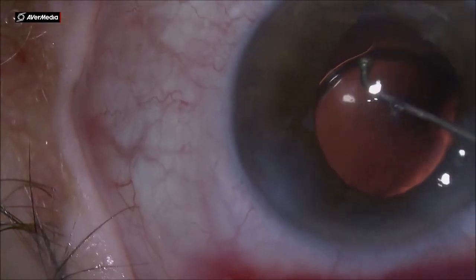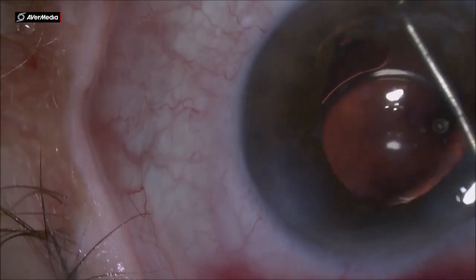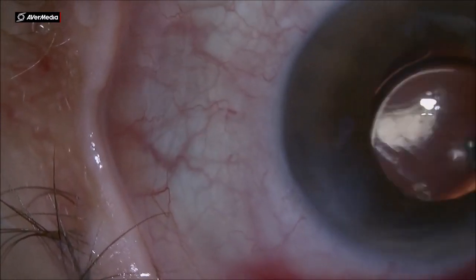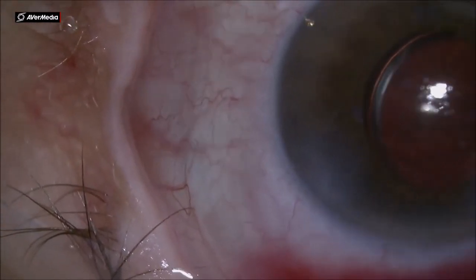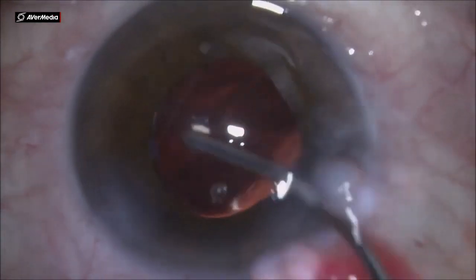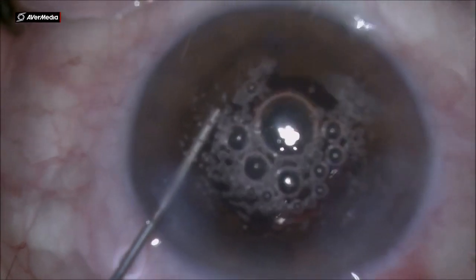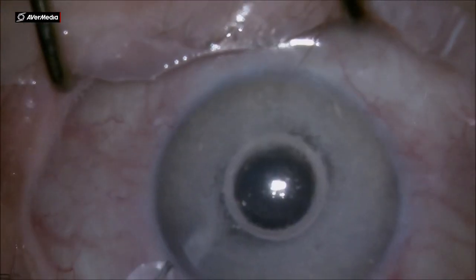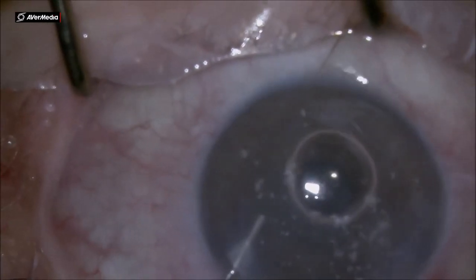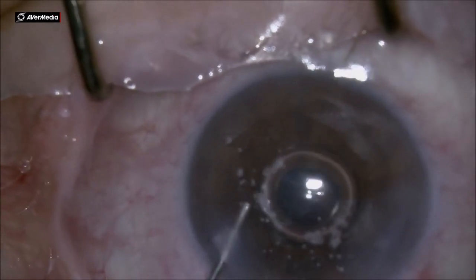I am placing the IOL inside the sulcus. It's a small capsule and that will ensure good IOL support. Using the aspiration needle and flushing out the viscoelastic, and using some triamcinolone to check if there is any vitreous — there is no vitreous inside the anterior chamber. So that's the end of the case.